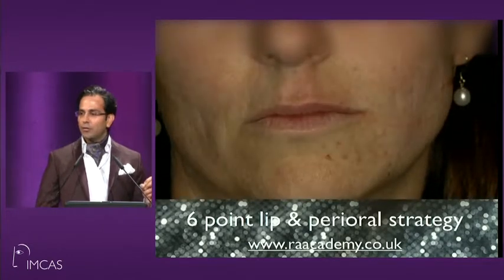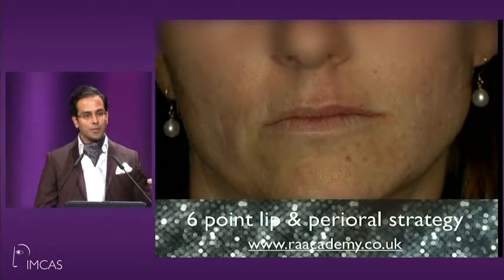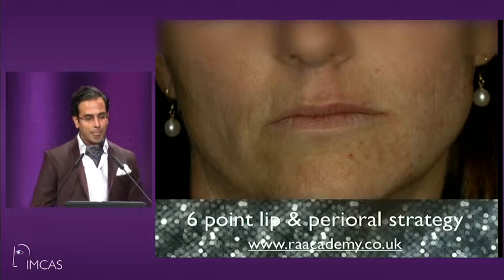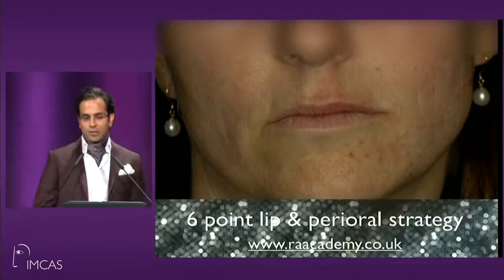Look at how the perioral lines have already started to reduce, because we're restoring the frame of the lip tissue instead of needing to inject lines and wrinkles, which we don't do so much these days. But if you want to go direct, there's still an option to do so.